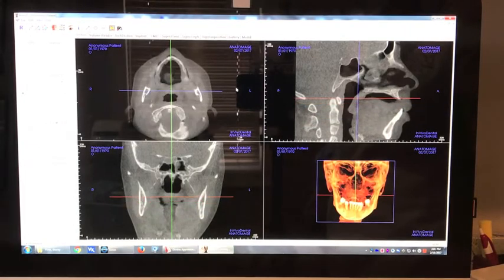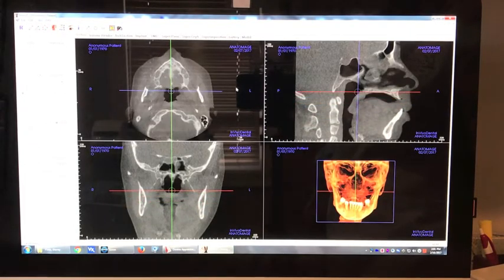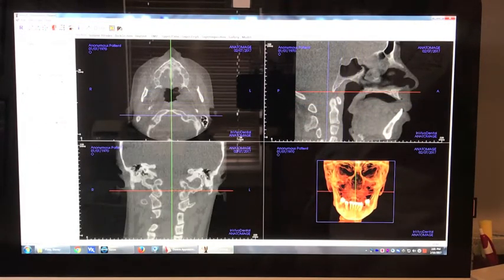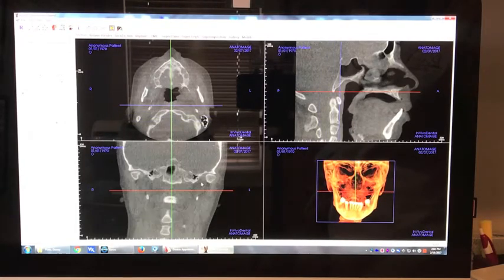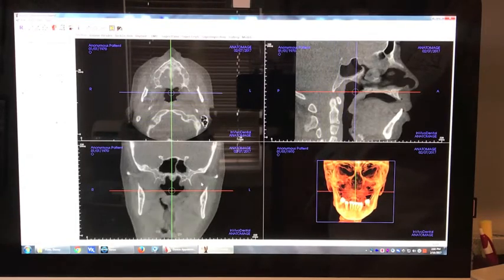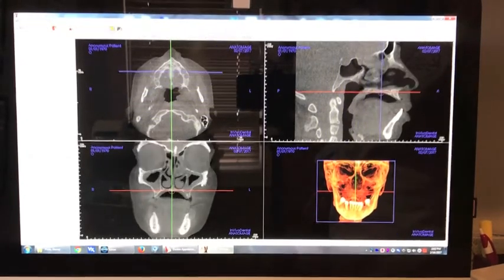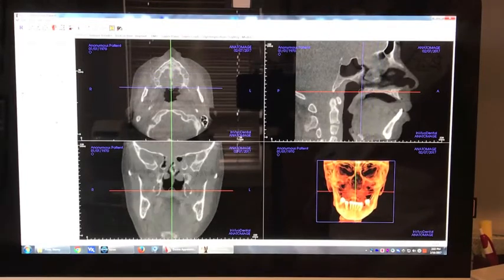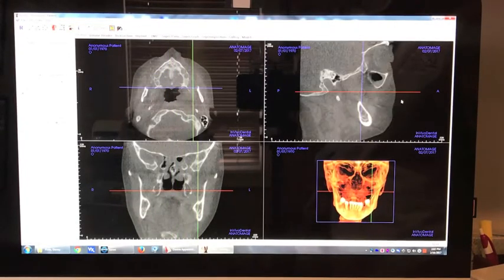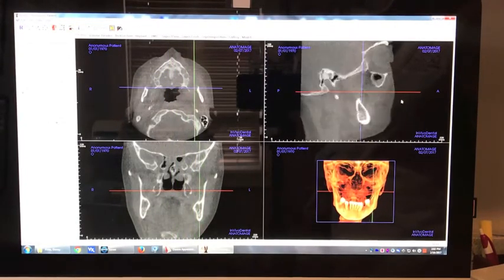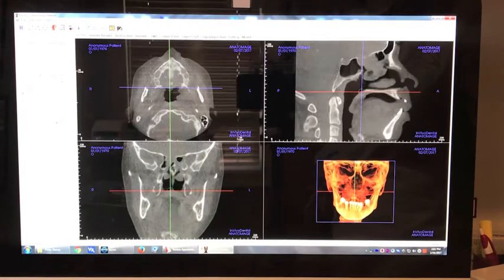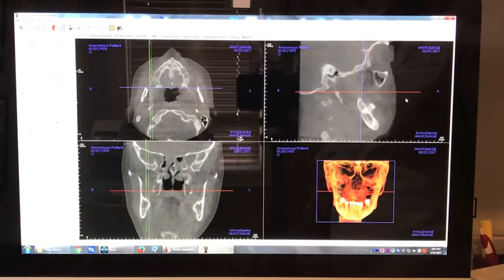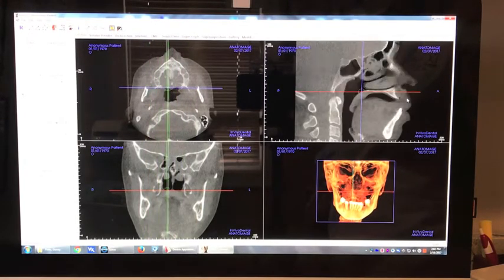A preliminary CBCT scan was taken to determine if the patient would be a good implant candidate. A CBCT scan gives a three-dimensional image of the patient's head. You will notice that with this image we are able to scroll through the scan in three different planes: from top to bottom, from back to front, and from left to right.